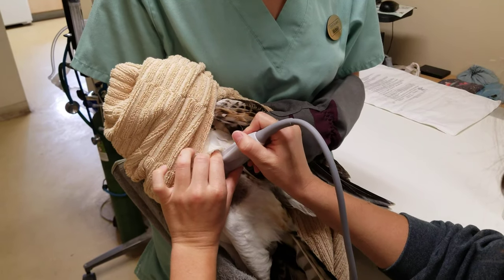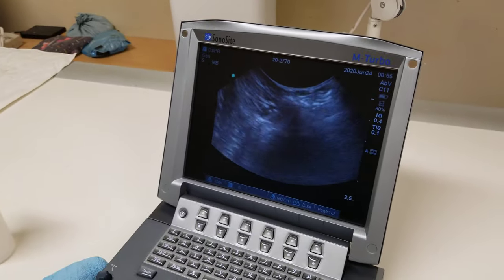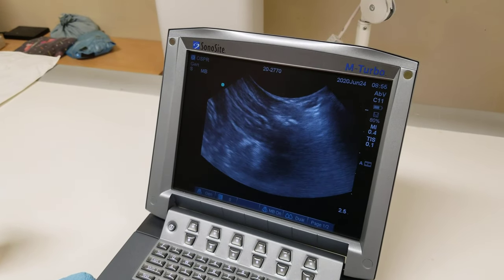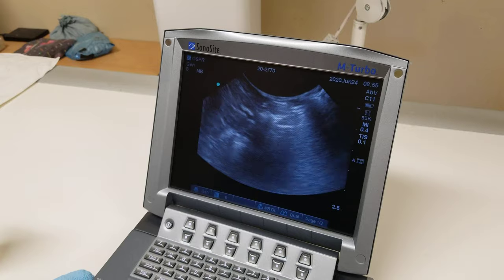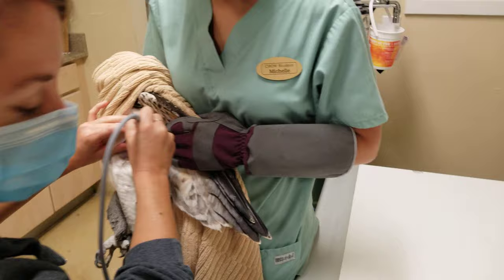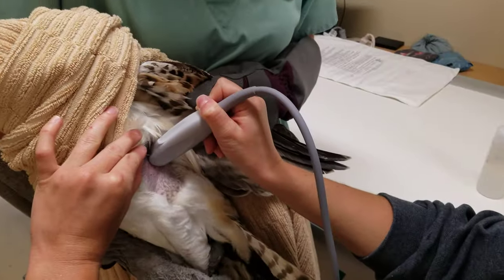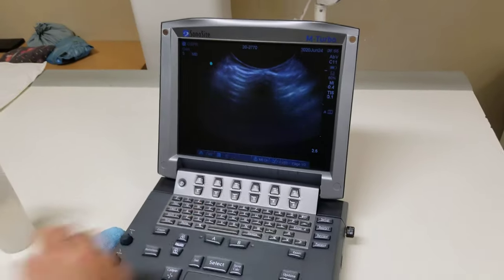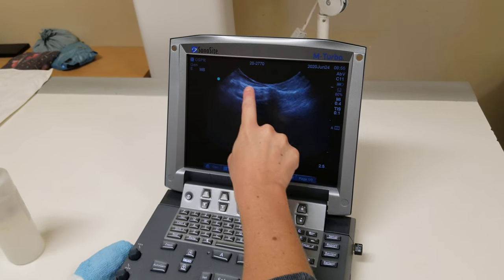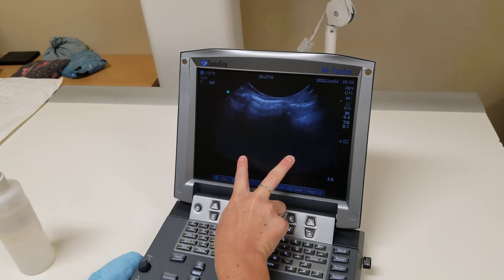We're going to find our first rib space here. If we go too cranial underneath the shoulder, we start to get into the interstitium — the tissue before the lungs — so we want to move just a little bit farther back. We're going to find our gator sign, right here between the two ribs. The gator sign is formed by these two rib heads, which look like the top of a gator's head.